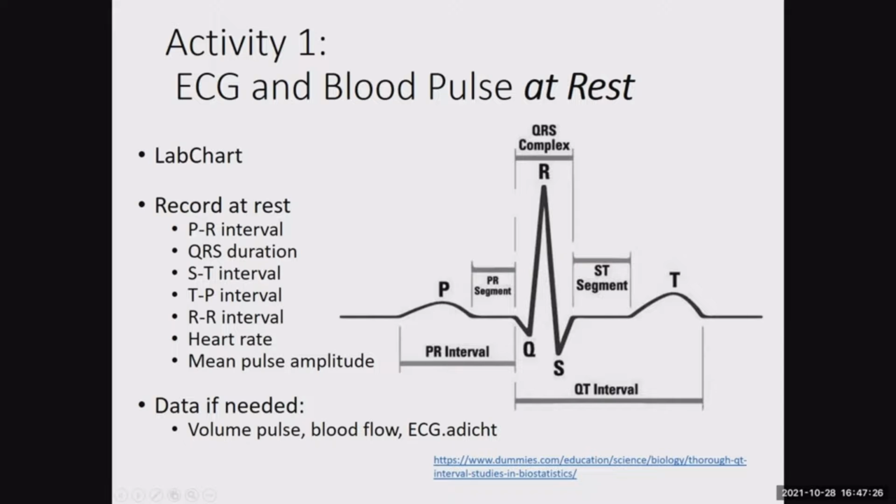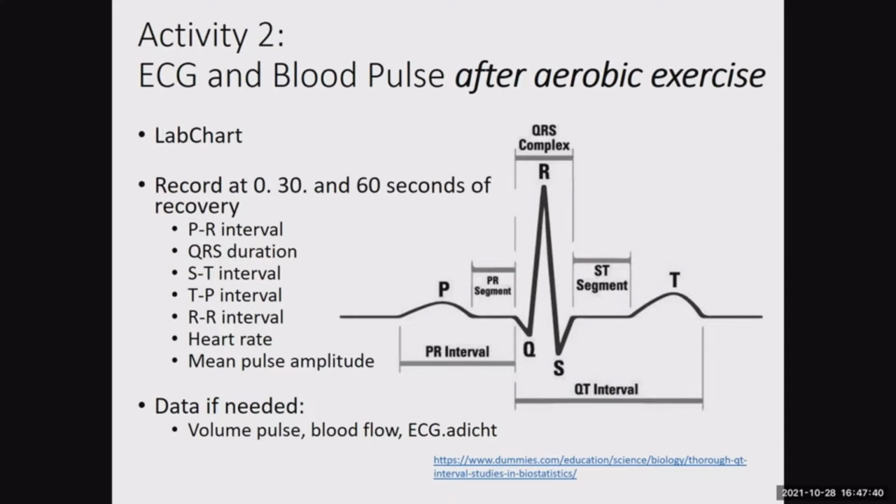Again, if there are problems with the data, your lab instructor may tell you to use the mock data that's available on Canvas. So once you've been able to get good readings at rest, you're going to have your subject exercise like we've done before, and then come back for the second activity.